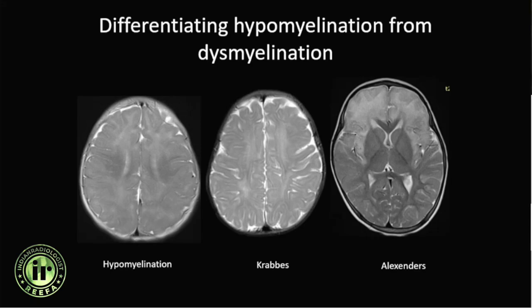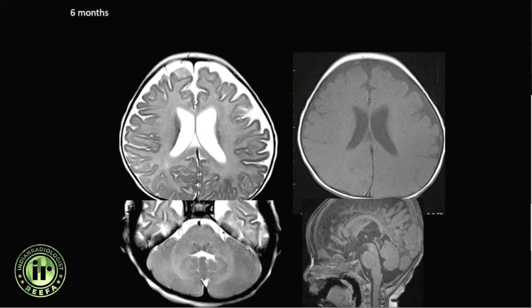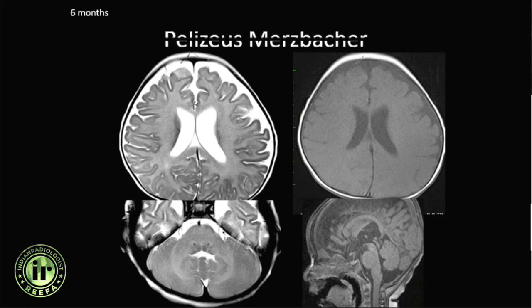In a six-month-old patient, there is hardly any myelination seen on T1-weighted images — not even in the dorsal brainstem or cerebellar hemispheres — and white matter is diffusely hyperintense on T2-weighted images. For a six-month-old, this represents delayed myelination. This patient was diagnosed with Pelizaeus-Merzbacher syndrome.